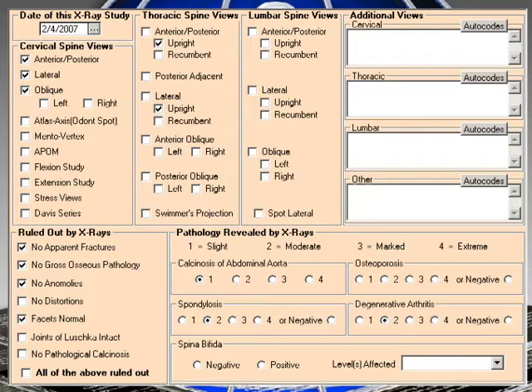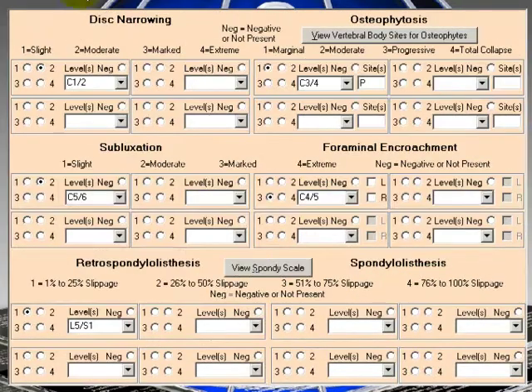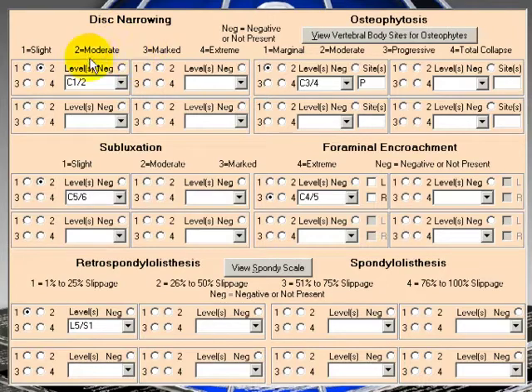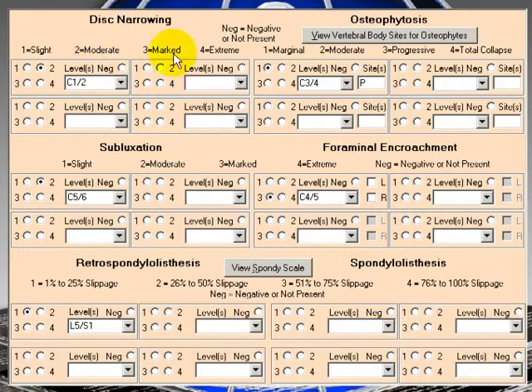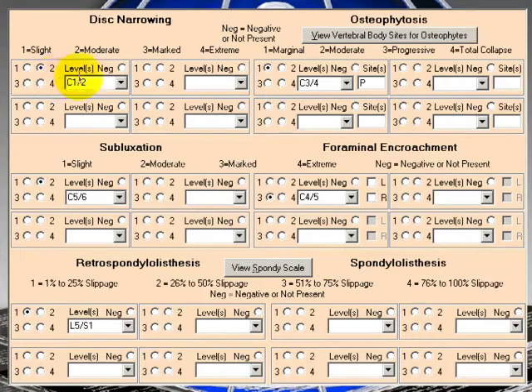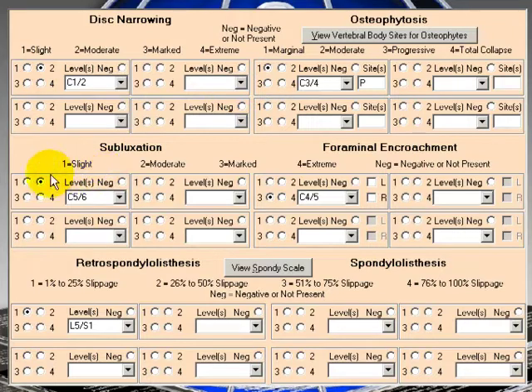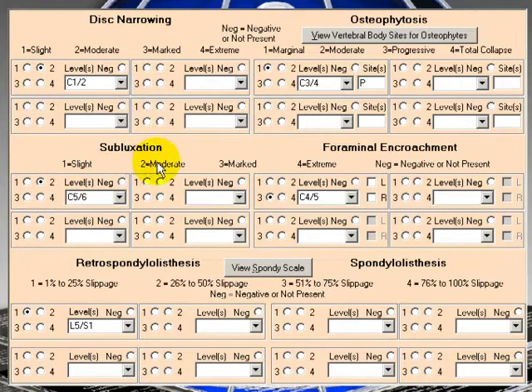Now, if I hit the next screen, here then we have disc narrowing, osteophytosis, etc. Again, you have a little scale here, slight, moderate, marked, or extreme. So here we have moderate disc narrowing at C1 to 2. Here we have, again, moderate subluxation at C5 to 6.